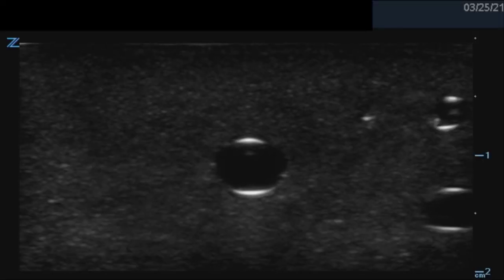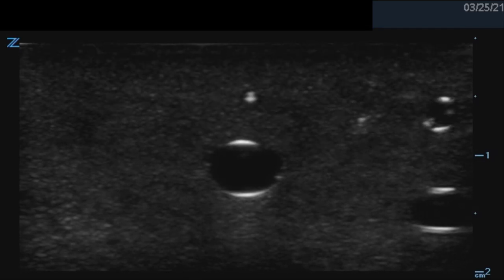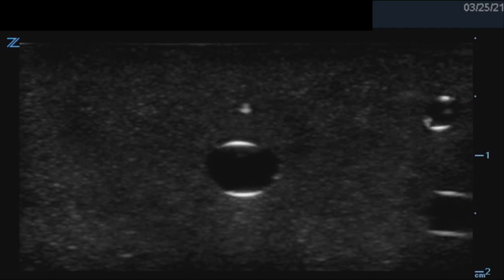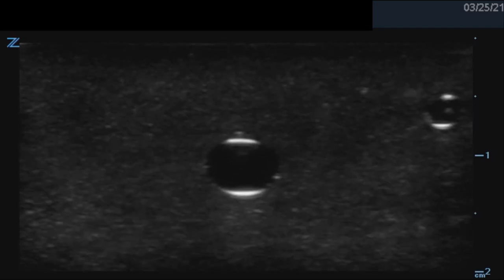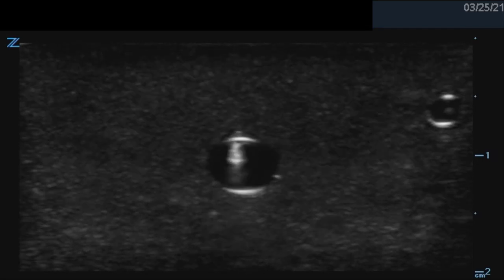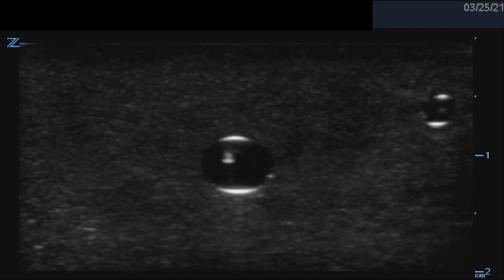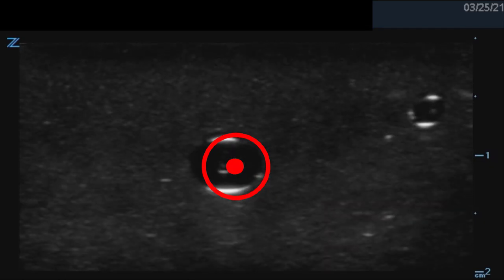Here we see a view of the needle tip in the process we just described. Notice how the needle tip comes into view, and as the probe is advanced, it disappears. It reappears as the operator advances it in small increments. When the needle tip is in the center of the vein, we have a view which is described as the target sign.